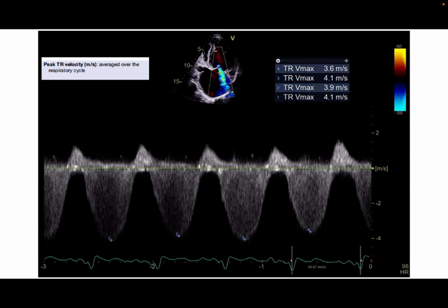In primary pulmonary hypertension, group 1, TR is elevated without elevated left atrial pressure. So TR alone doesn't diagnose post-capillary pulmonary hypertension; you need the context.